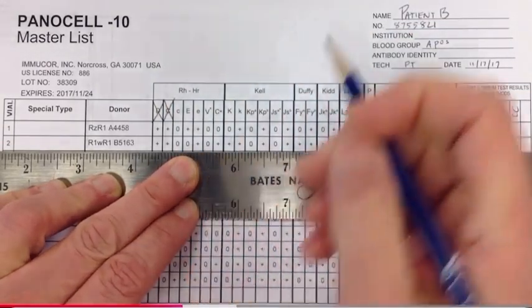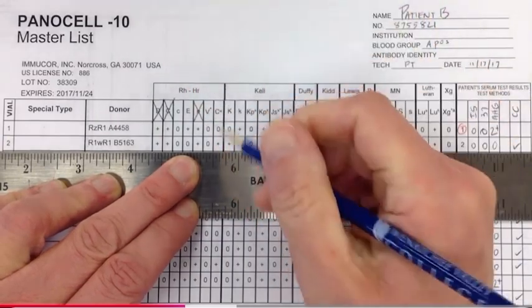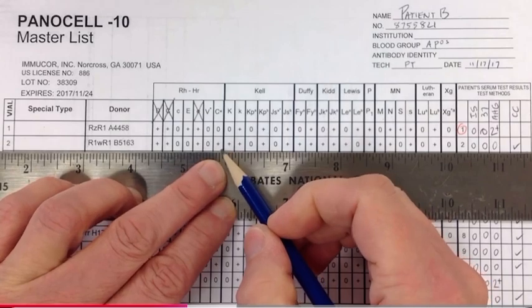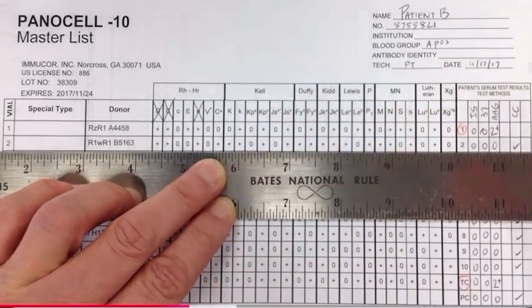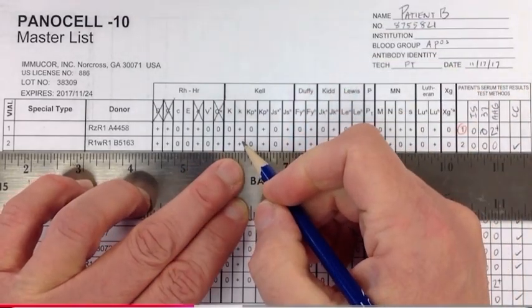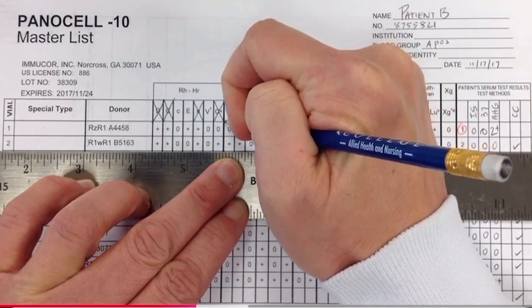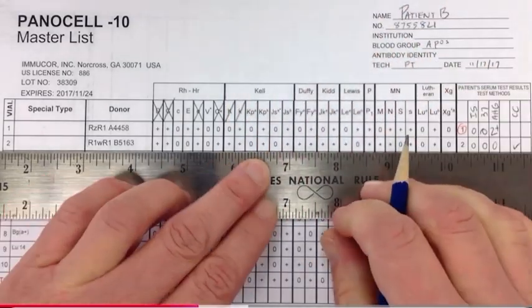Okay, big E, little e. Okay, little e is homozygous, let's cross it out. Okay, now CW here, it's by itself, so since there's no competition with it being homozygous or heterozygous, I'm just simply going to completely rule it out with an X. Okay, big K and little k. So Kel, those are both heterozygous, so I'm going to give them just a slash like that. We'll come back to those.